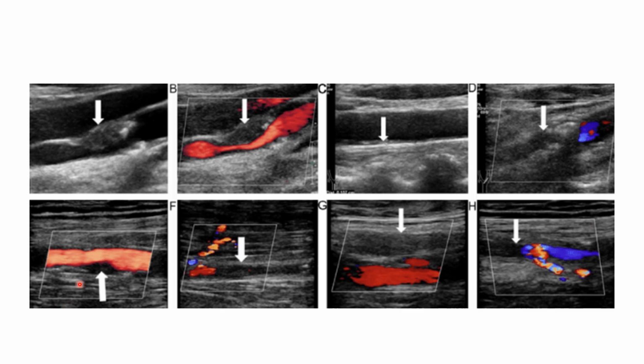Here you see how that disruption of the intimal wall appears a little bit differently. It's a little bit hypoechoic this time, and yet you can certainly see the disruption of the flow. So where this might have been something overlooked on B mode imaging, having that color and watching the contour of the color can be very useful.